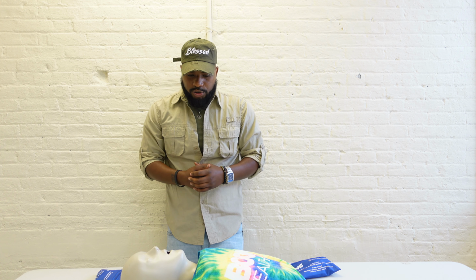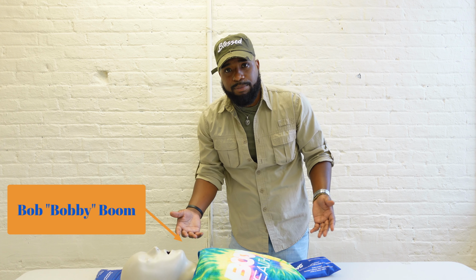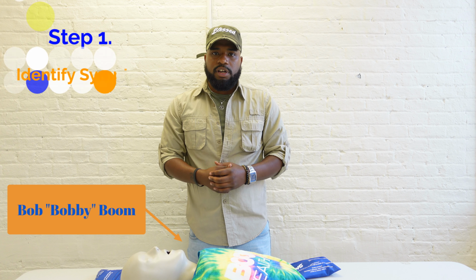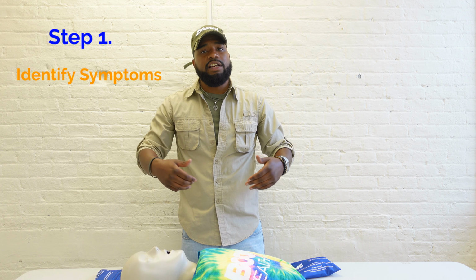Today, we'll be showing you how to reverse an overdose via the administration of Narcan. Who we have here is Bob, and obviously he's succumbing to an overdose. Now, the first step would be to identify the symptoms of an overdose. Now, the symptoms may include shallow breathing, confusion, lessened alertness, and loss of consciousness.